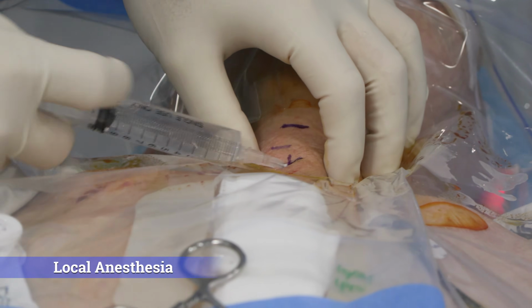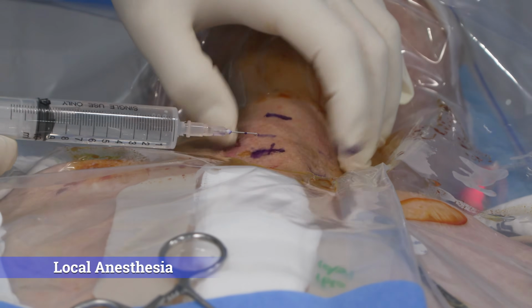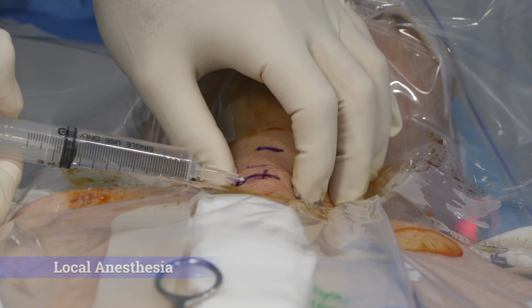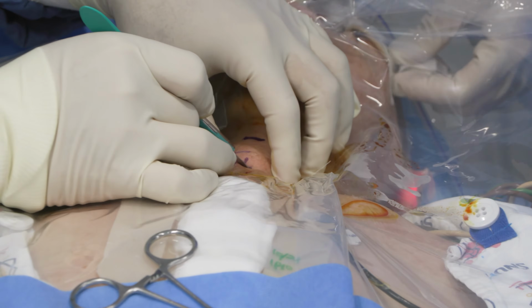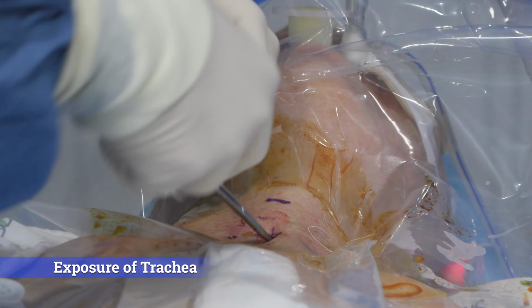The patient is already sedated with agents such as midazolam, and additional local anesthesia is administered using lidocaine. Although a vertical incision is commonly used, a horizontal incision can also be made to avoid interference with a sternotomy incision.